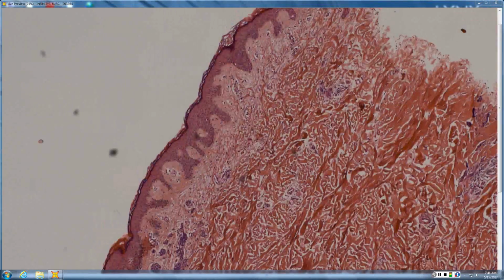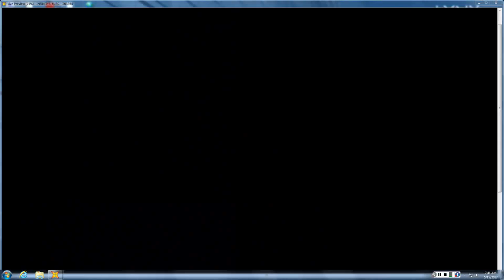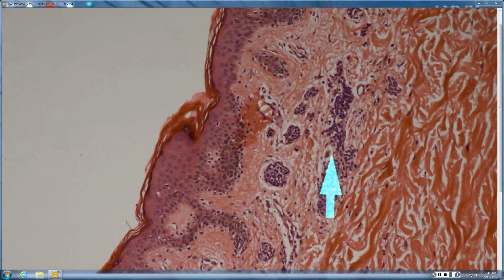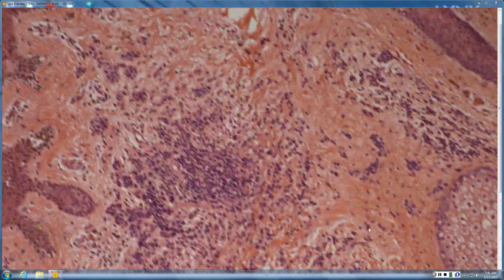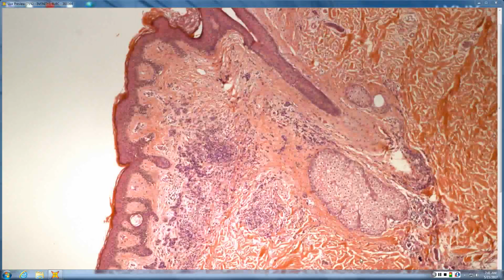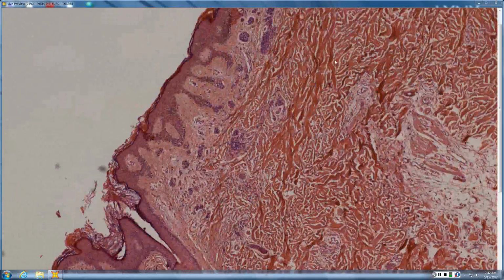Okay, so this was an atypical mole that was removed. So atypical mole, rule out melanoma. That was the history. Right, so looking at it, it looks pretty benign, with some maturation. Yeah, and they're kind of tight perivascular arrays, so patchy perivascular and then interstitial melanocytic goes with what kind of a melanocytic nevus? Like a congenital pattern nevus, and those are often a little large and irregular, so that kind of makes sense that they would have biopsied that to rule out melanoma.